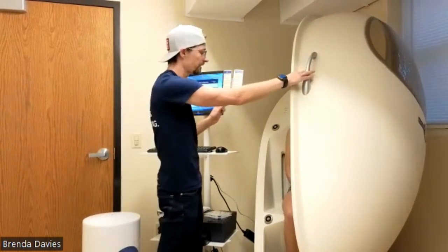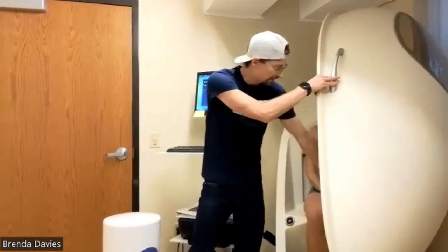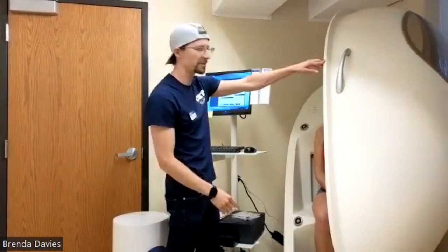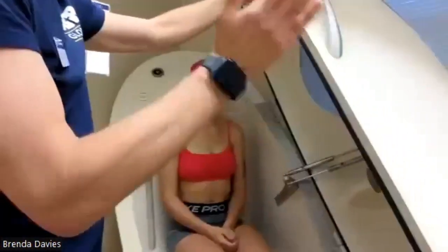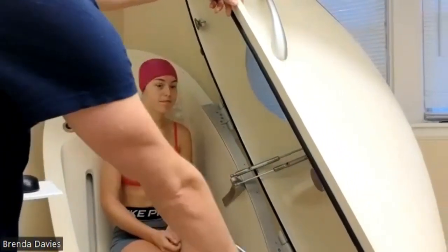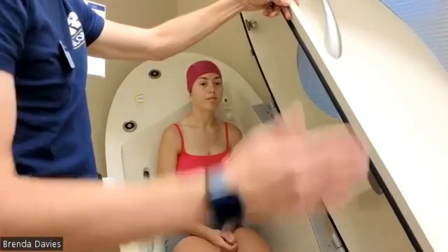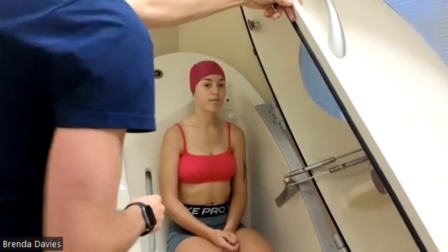And yes, if you are feeling claustrophobic, there is an emergency release valve button that's right by your side. So for those of you that are online, I don't know if you'll be able to see it, but there is an emergency cutoff switch. This does seal, and then the pressure is changed with the emergency cutoff switch right at the bottom there. We also have high-powered magnets around the edge to really lock in the seal. The gasket here is going to keep that air and be able to generate the pressure from behind the seat.